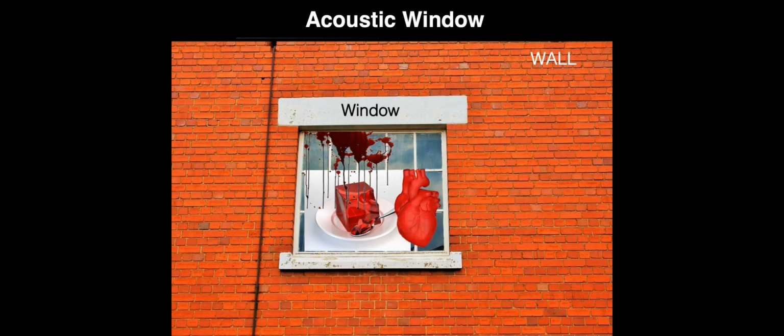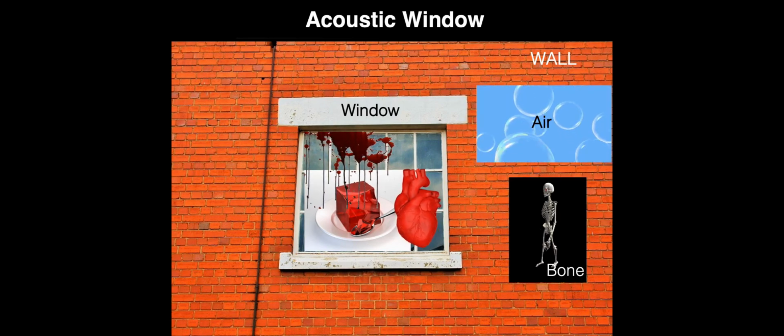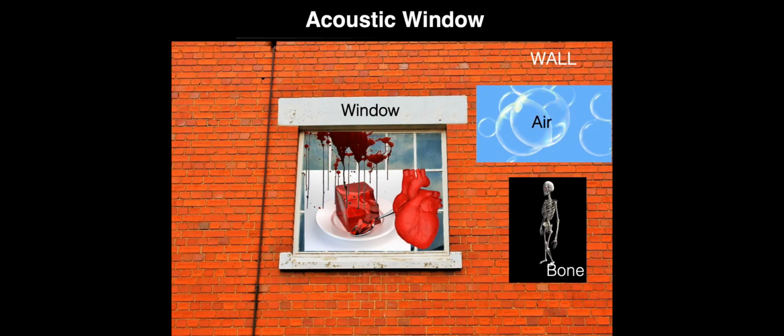Try to avoid acoustic walls. Acoustic walls are tissues or viscous structures with high impedance. These include air, either external to the body or within hollow viscera, and also bone.